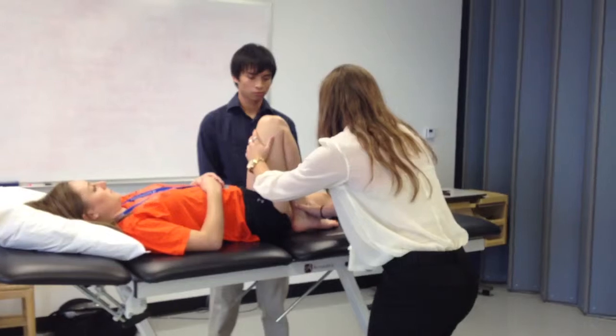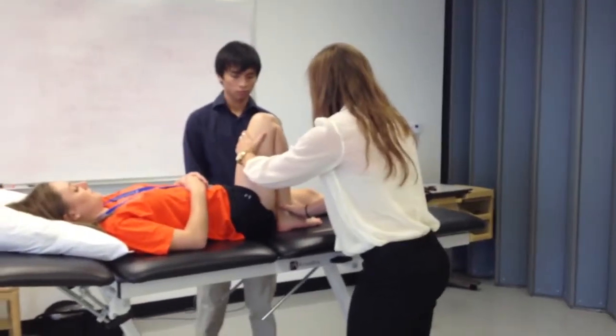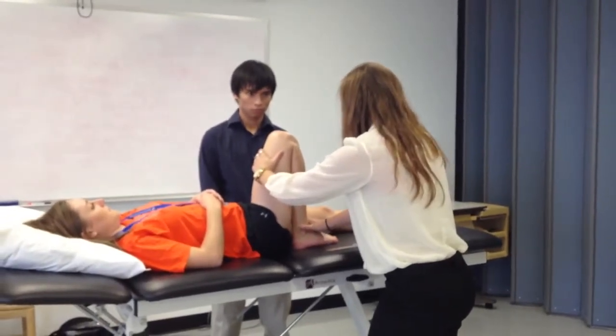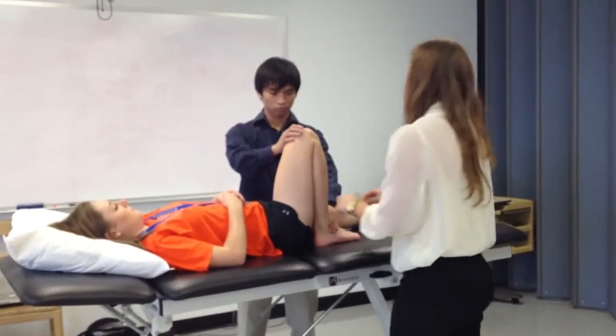The end of the range of knee flexion occurs when resistance is felt and attempts to overcome the resistance cause additional hip flexion. Measure this angle and record appropriately, making sure to document resting position prior to.